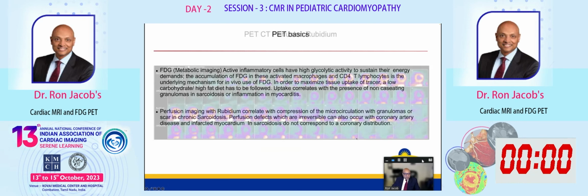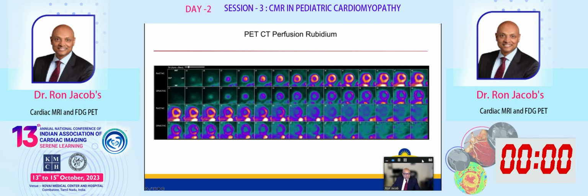So moving on, this is the patient's perfusion imaging. And what we're looking for here is a perfusion defect. Generally, with the rubidium, you're looking for a perfusion defect in the same area as LGE. I will say that LGE is more sensitive for the involvement for cell necrosis or scarring than rubidium. And it's a fundamental property of the resolution of PET that you may not see the perfusion defect unless it's larger and transmural.